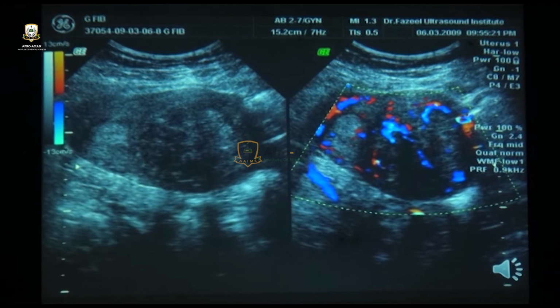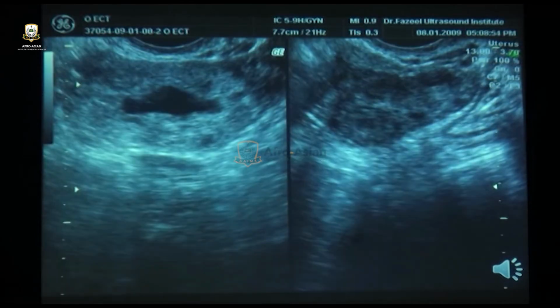Okay. This one. This is a fibroid. Fibroid with linear edge effect shadows. On one side, this is the uterus with fluid inside in one adnexal area. This was a case of ectopic pregnancy. Urinary pregnancy test was positive and the uterus is containing a pseudogestational sac.